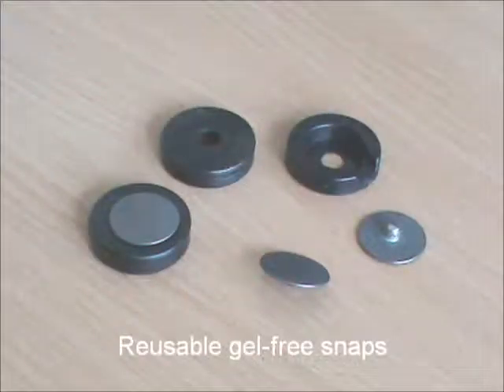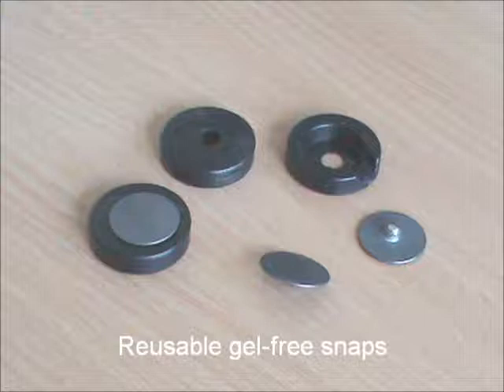These are the gel-free snaps. They give a less accurate reading but lower running costs. With either snap, you'll get a more accurate reading if you wipe the skin first with alcohol.